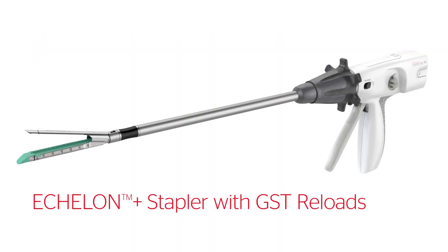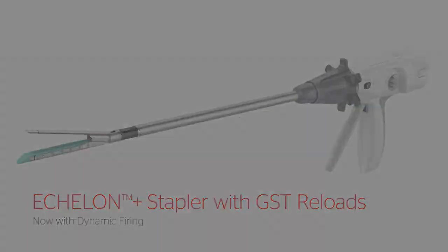The Echelon Plus stapler with GST reloads, now with dynamic firing for advanced security even in challenging conditions.